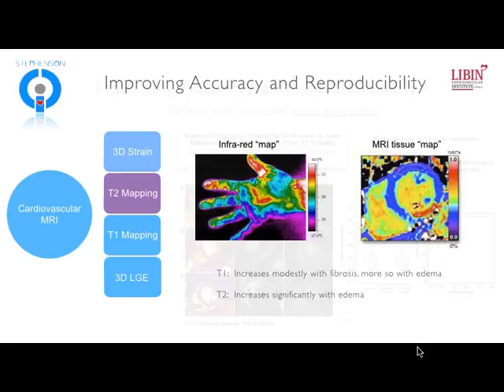In the field of tissue imaging, we've got the more recent advancements of T2 and T1 mapping. Essentially, tissue mapping is akin to doing infrared imaging of biological structures, such as trying to chase down people in the woods after they've broken through a bank vault. And we use infrared imaging to try to track people down. Well, we can do the same thing with MRI.